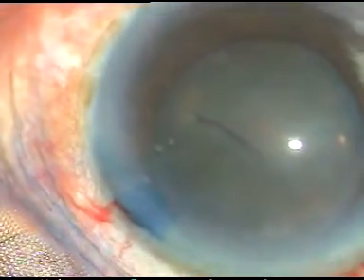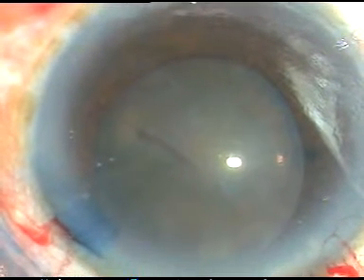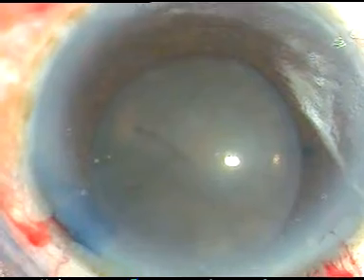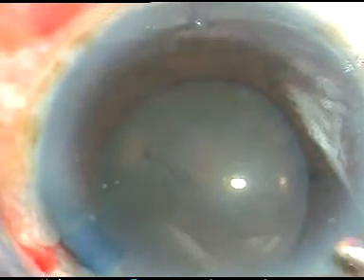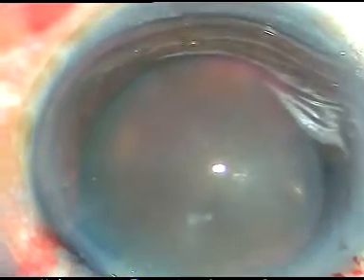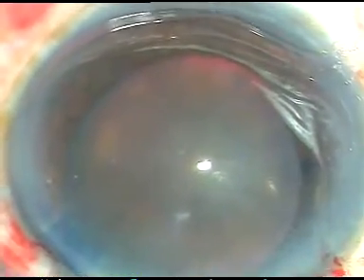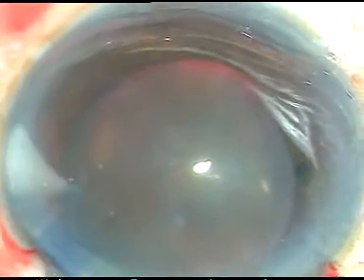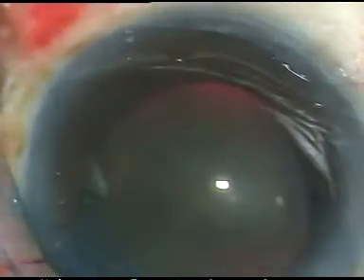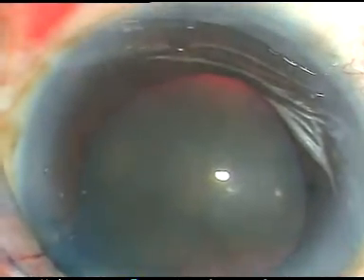Underneath this Viscoat, I am going to use a little other viscoelastic substance. In this case, this is HPMC — hydroxypropyl methylcellulose — just over the anterior capsule of the cataractous lens. This HPMC has pushed the Viscoat upward so that it sticks firmly to the corneal endothelium. Now, one more paracentesis incision has been made on the right side of the main incision.